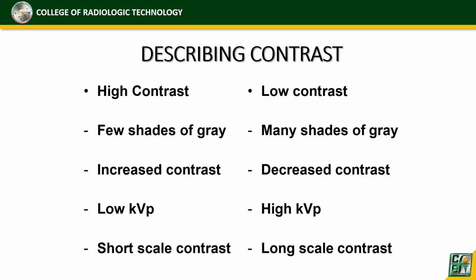When we say high contrast, it has few shades of gray. Konti lang yung shades of gray, or basically between black and white only. Increase yung contrast niya kasi madali nating madi-distinguish yung mga structures, mga adjacent body structures doon sa image or sa radiograph.